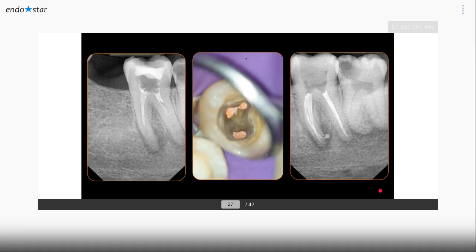For sure, the tooth number. Sorry, it was not 36. It was 37, because this is tooth number 38, and tooth number 38 will be extracted because there is no antagonist. I was thinking, let me make endodontics in this one, but they already extracted it.